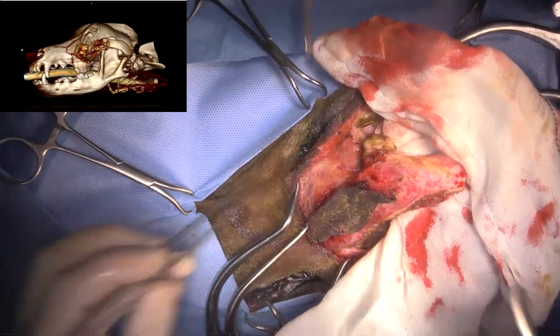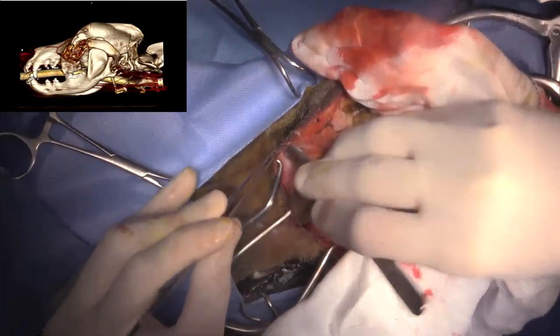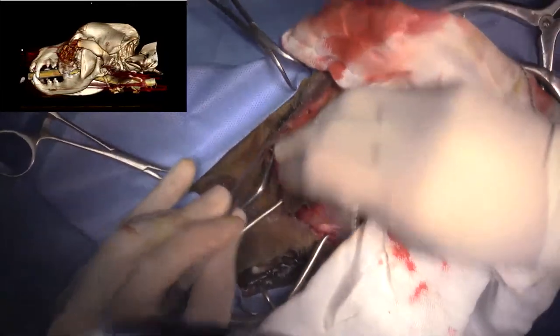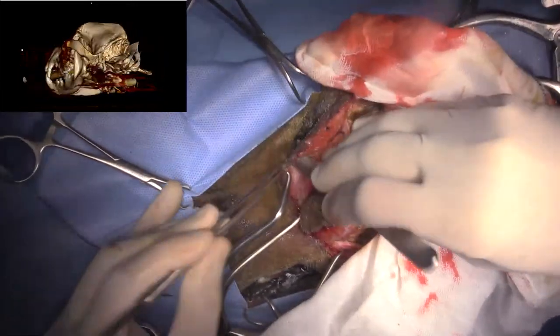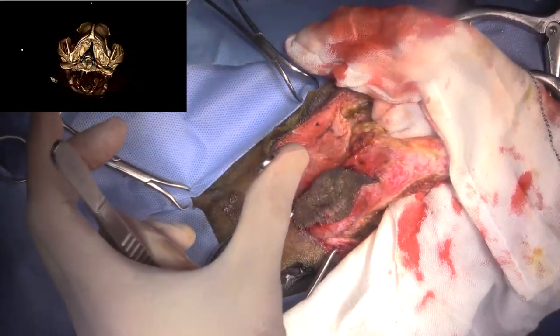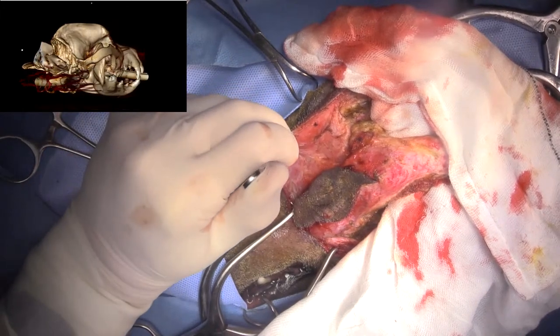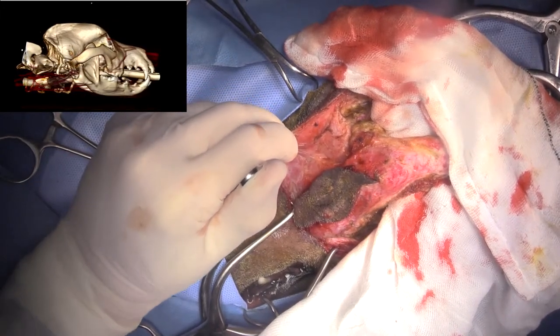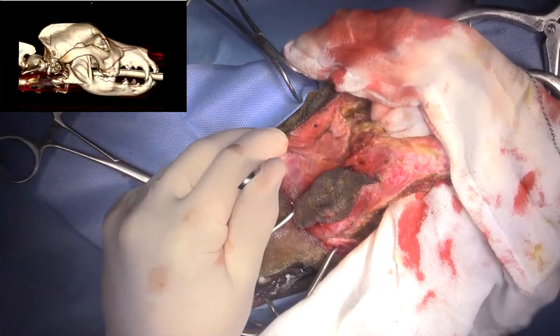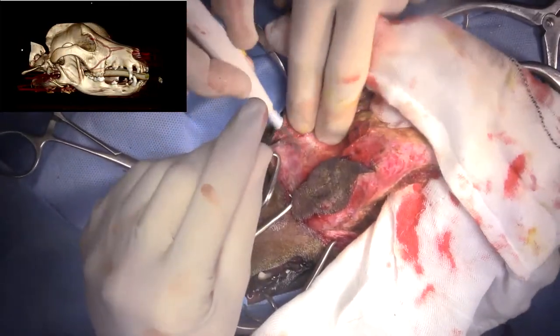Jeff, do you want to switch sides with me, please? Yeah, sure. So Jeff, to hold on to this home in here, up over the top of the nasal bone. My head's probably going to get in the way here.